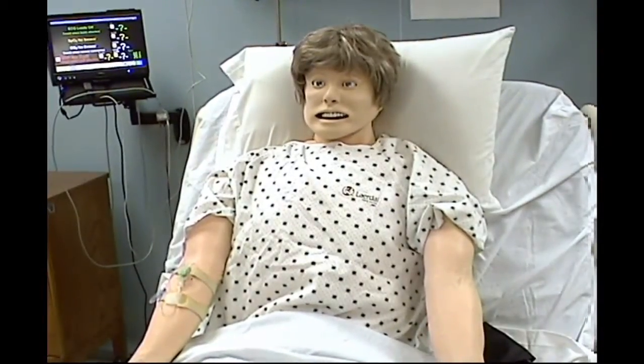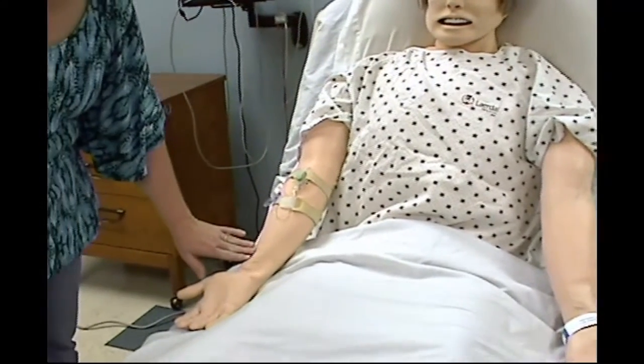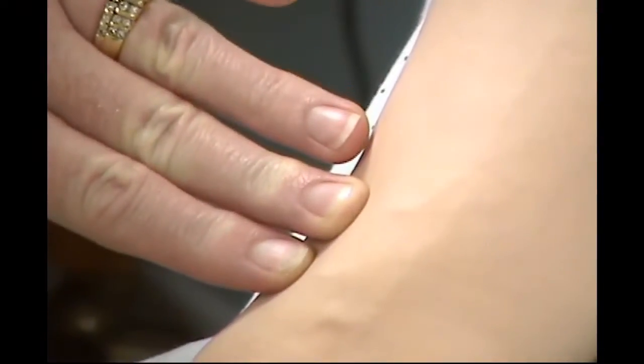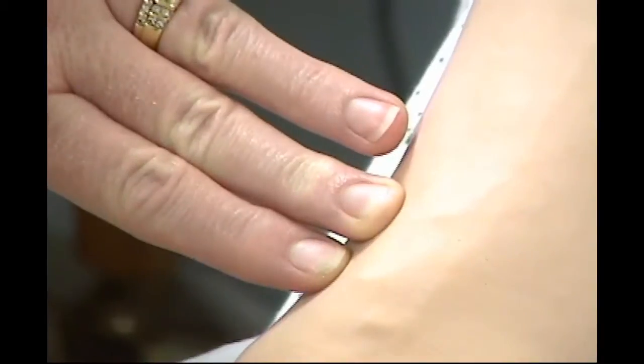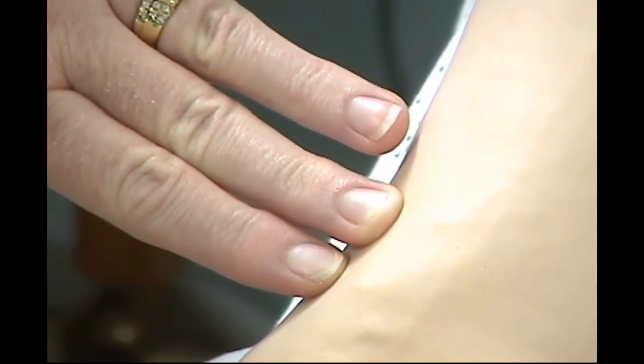SimMan3G has bilateral palpable radial pulses. To activate the pulse, find the soft spot approximately 2 inches up on the thumb side, press all the way down to activate, and then back off slightly until you feel the pulse. If you press too hard, you will occlude the pulse.